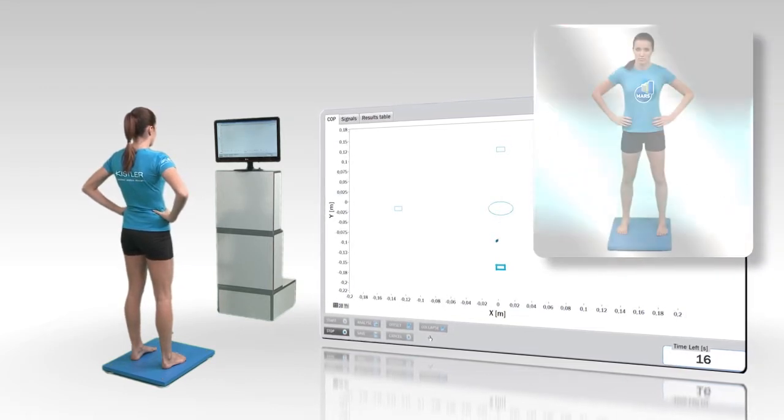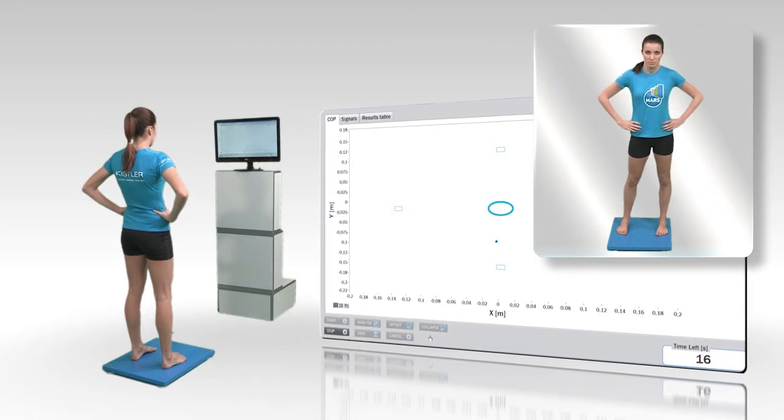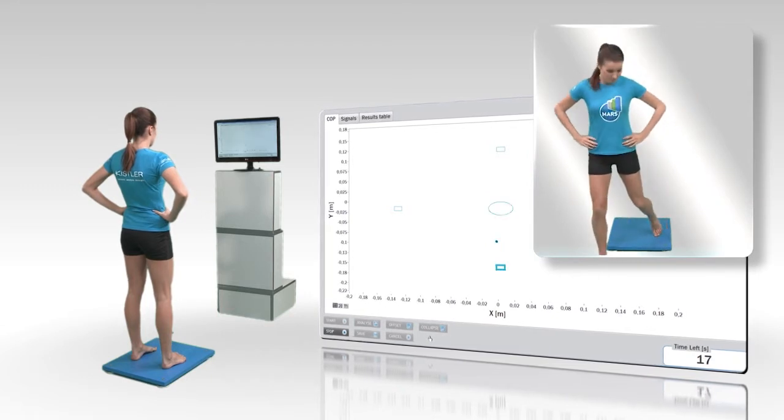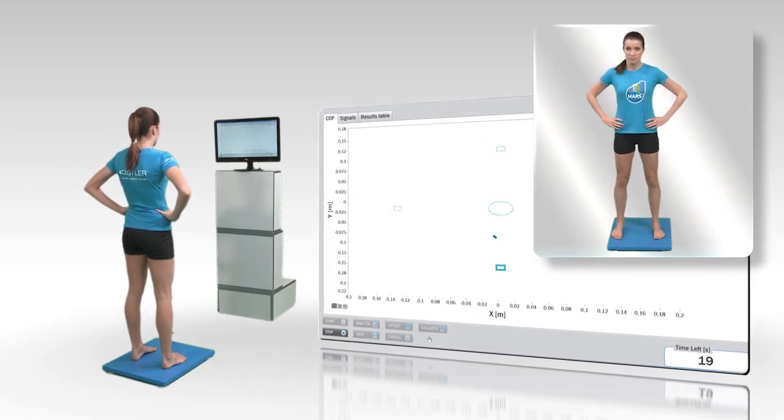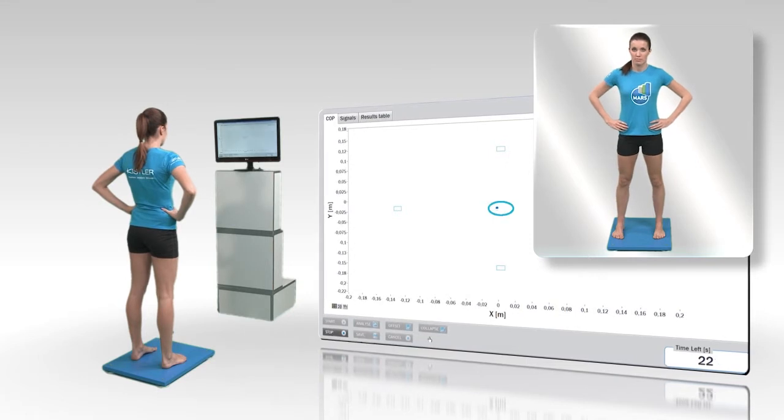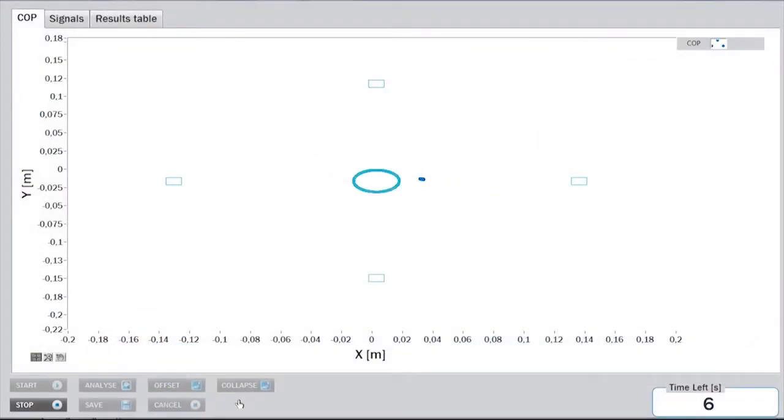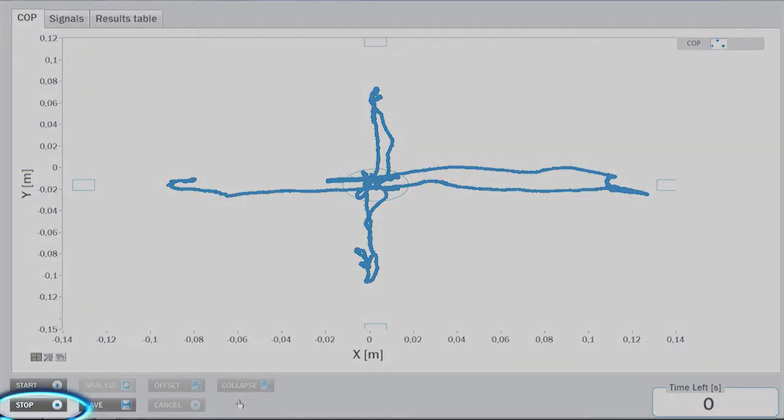If the subject falls or moves, the measurement needs to be repeated. The measurement stops automatically after the predetermined time period. It can also be stopped manually by pressing the Stop button in the lower panel.